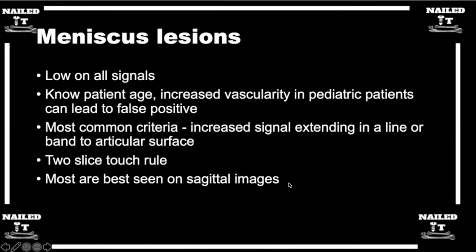Yeah, and I think you just touched on all this, best seen on sagittal images. I read that when you're looking at different tears, you should see that increased signal intensity on at least two different images in order to call it a meniscus tear. Correct.